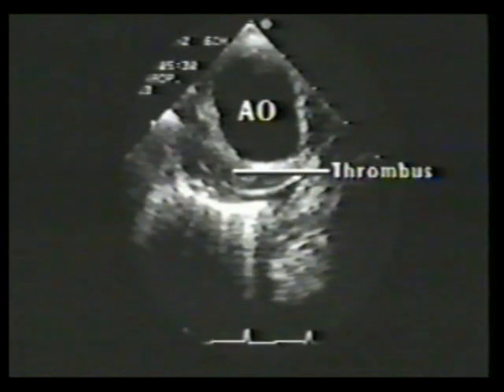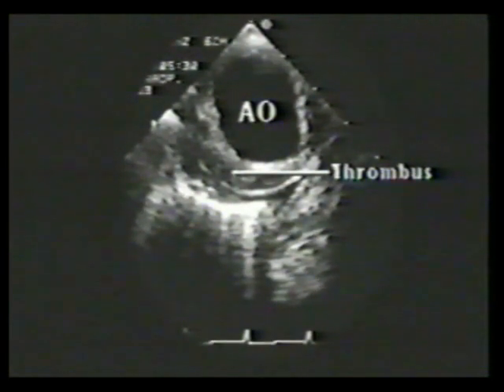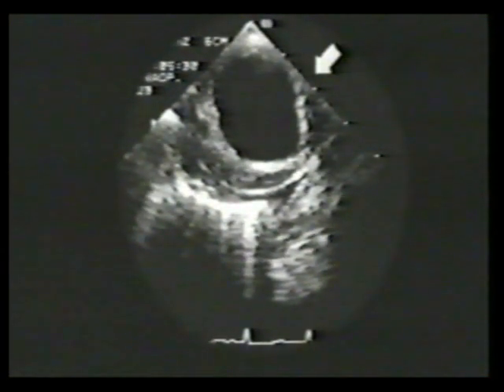This is a transesophageal image of the descending thoracic aorta. Since there are no landmarks within the descending aorta, it is important for the echocardiographer to document the level of each image by noting the centimeters, measured from the patient's incisors, that the probe has been advanced. This image was obtained at 20 centimeters and shows another accumulation of thrombus. It is critical to determine if this thrombus is layered over the intimal surface or if it is within the wall of the aorta.